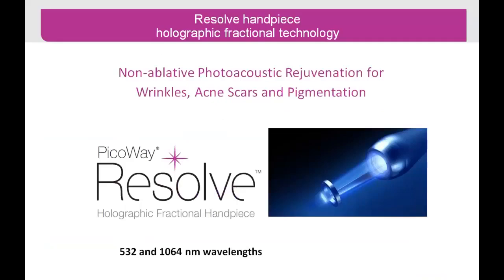So the Resolve handpiece comes in two wavelengths, which is the 532 nanometer and the 1064, and it's a fractional non-ablative photoacoustic way of generating tissue remodeling.